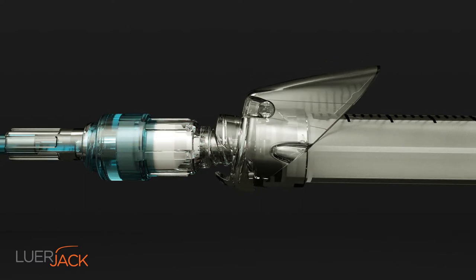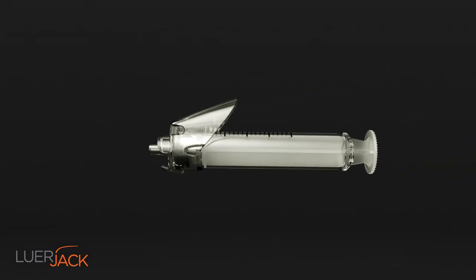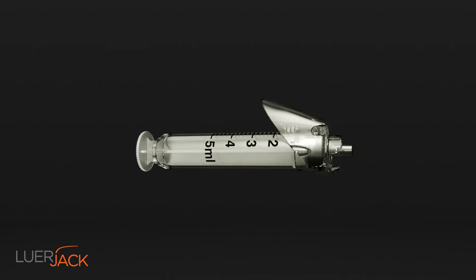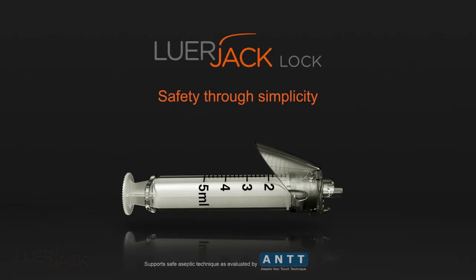Even a lock syringe can easily be disconnected from female connectors or needles with this non-touch click and release technique. Luerjack lock supports better practice and thereby improves the safety of both the patients and the healthcare professionals.